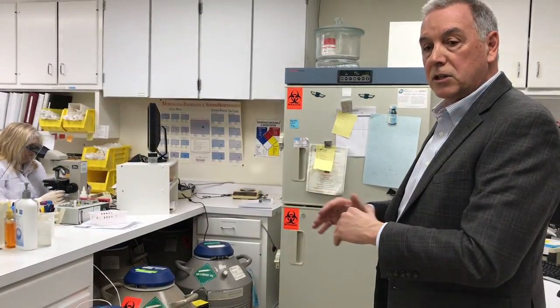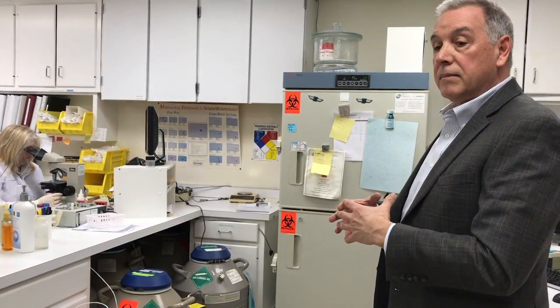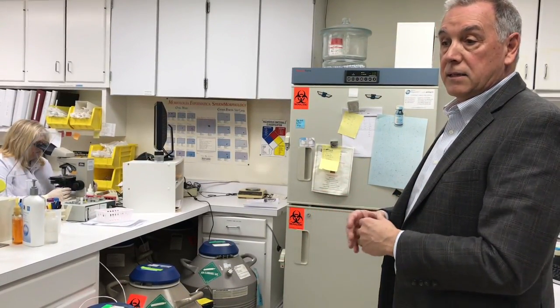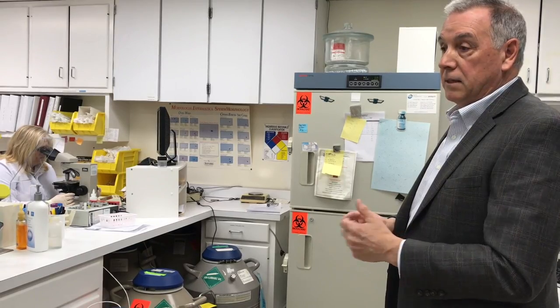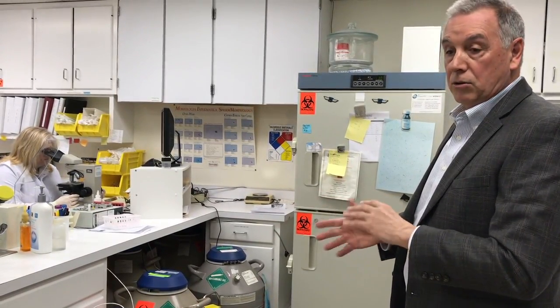Whereas the bulk tanks need to be hooked up to usually an autofill system. They lose a lot more liquid nitrogen a day, and the other risk that we see in the large tanks is the number of patient samples that you put into these tanks. The bulk tanks will hold several thousand samples, and each one of our tanks here holds around a hundred.